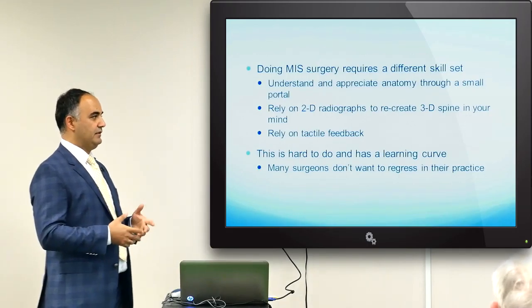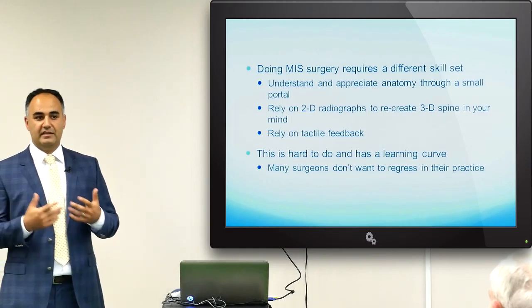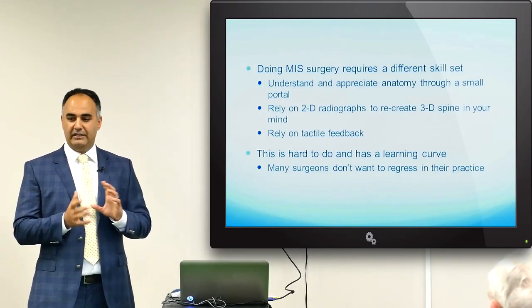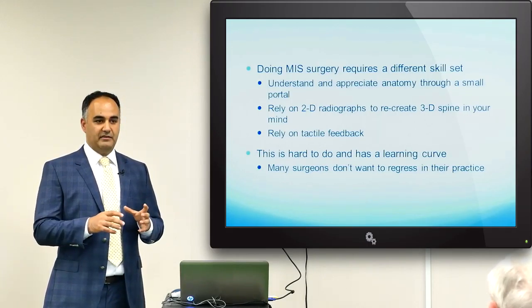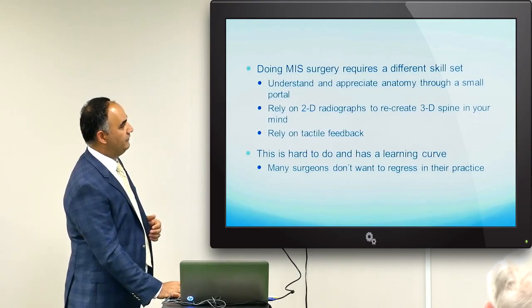You have to do this long enough, and this is where the next point is, that there's a learning curve. You have to do this enough so you can get that feedback and know where you are and not get lost. Because a lot of times, people who start doing minimally invasive surgery and haven't done a lot, they'll put that tube down and then they're completely lost. They have no idea where they are on the spine because everything just looks like one big piece of bone. But you've got to have that feedback to know.